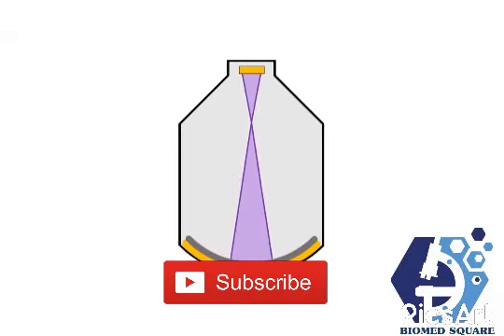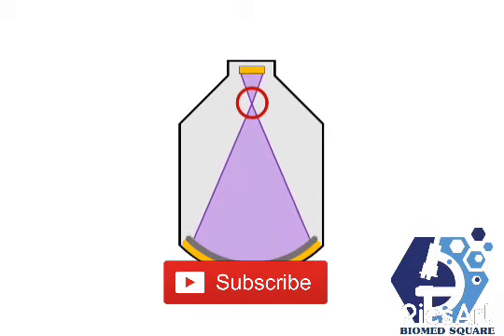Now watch it again, but this time focus on the focal spot. The focal spot is closer to the output phosphor when we're using a larger field of view versus when we magnify, that focal spot is going to get further away from the output phosphor.